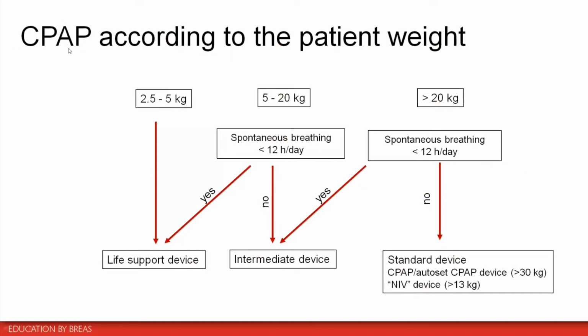So concerning CPAP, if the child weighs less than 5 kilos, usually we feel more comfortable using a life support device. This is because our way of functioning, with monitoring mainly during outpatient visits, will permit a good detection of the flow of the patient and reliable data that are very important for the management of the patient in our practice.